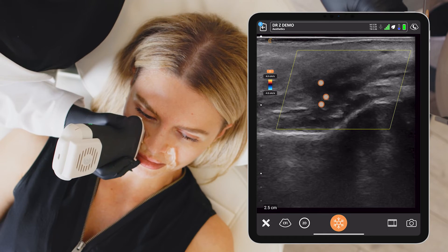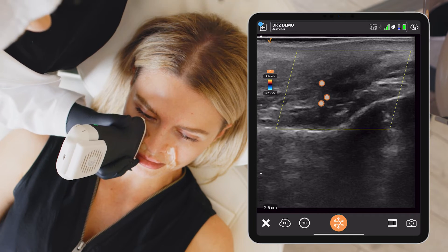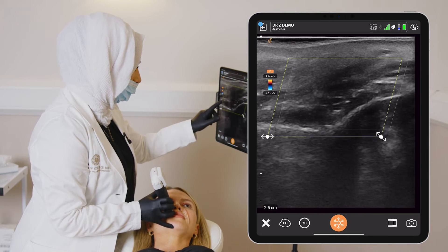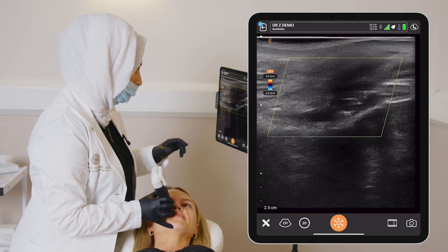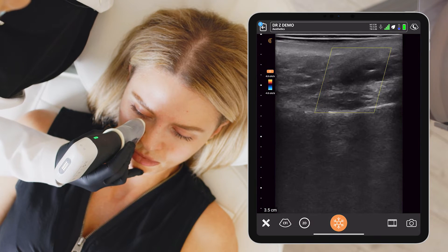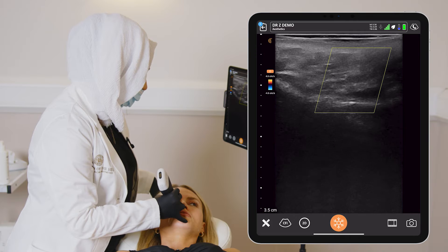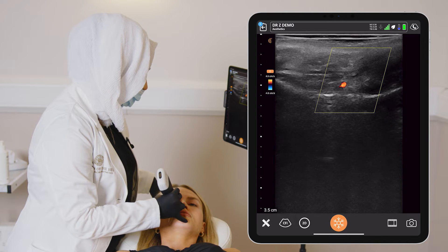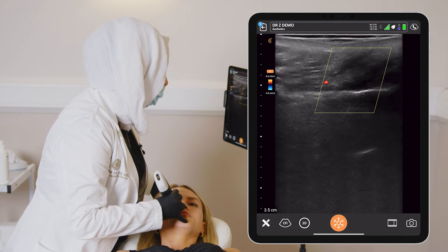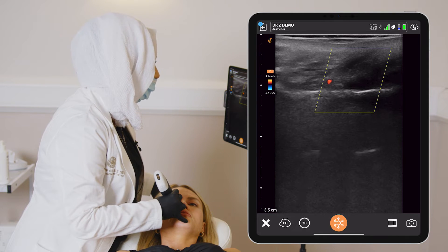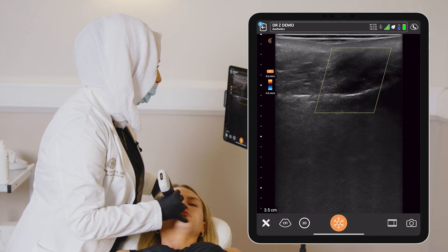You can see the old filler here, the piriform fossa. I'm looking for the presence of a vessel here. Back to the piriform fossa — this is the first place we're going to inject. Now that's interesting because now we can see if we go just high near the alar rim, we can see the vessel gets deeper.